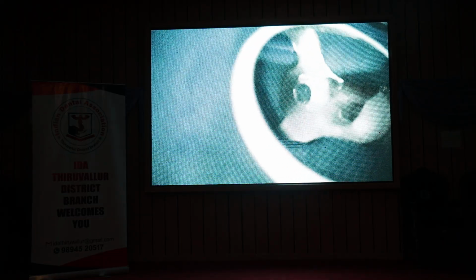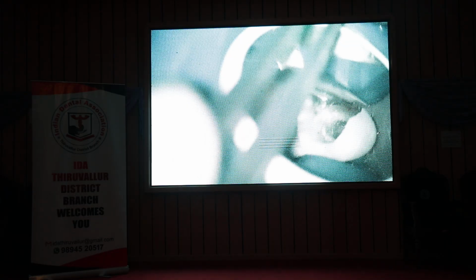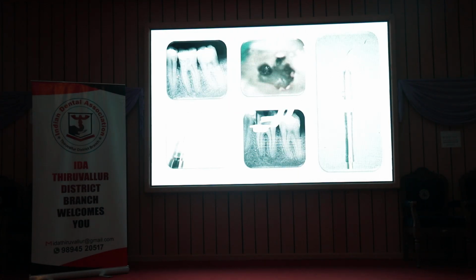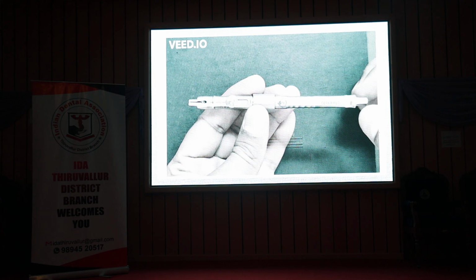So it was a merging canal, and failure to understand the anatomy has resulted in the instrument getting separated there. Then the other bit also was removed. Of course, it resulted in an even more complicated case. In this case, I will go and use the BTR pen. Just a little bit of this.